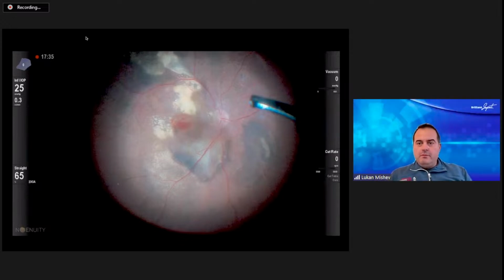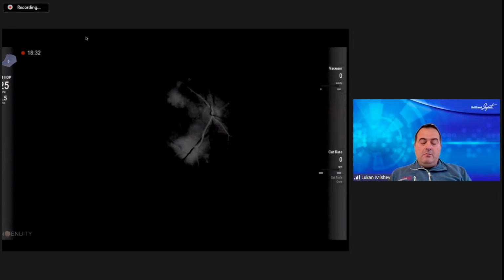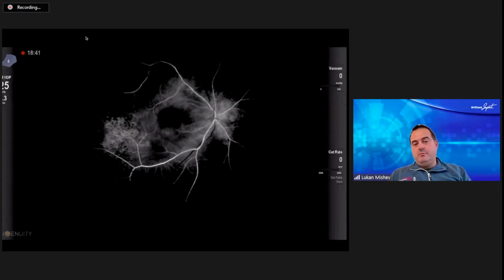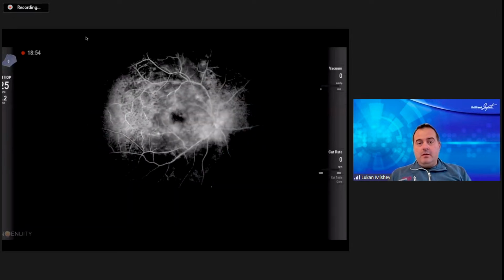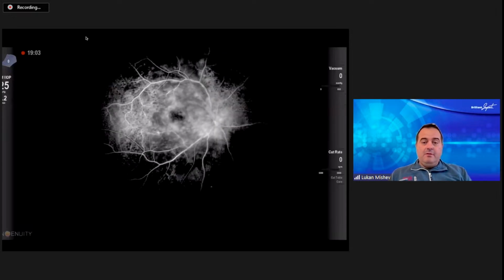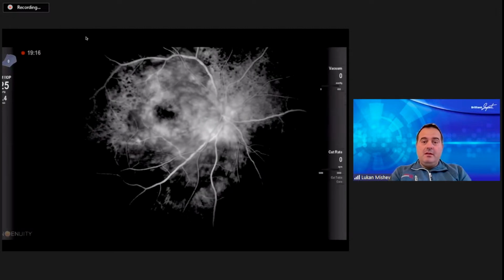Thank you, Hudson, and thank you, Alan, for inviting me to participate here and to present some of my work. This is a video of obviously advanced age-related macular degeneration, which is a good example of how well we can see all the vascular changes we might have in the fundus during the operation, because it was a case with hemophthalmos, so we were a bit in the dark about what lies behind, and now we can see quite well, and the level of the contrast actually is amazing here, what is happening in the posterior pole. So at least if it doesn't change our surgical approach, we might explain to the patient the next day after we clear the hemophthalmos what is the reason why he is not able to see like he wants to.